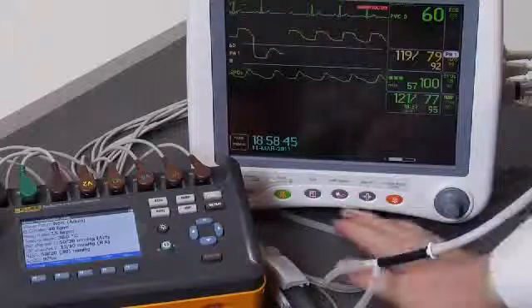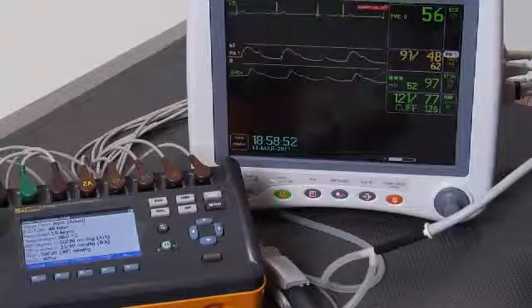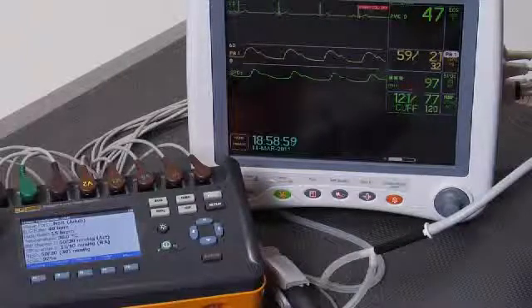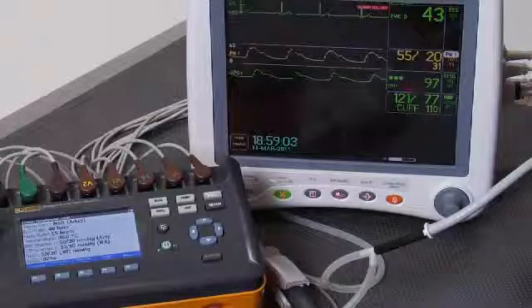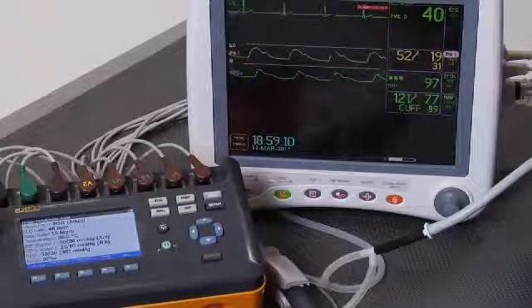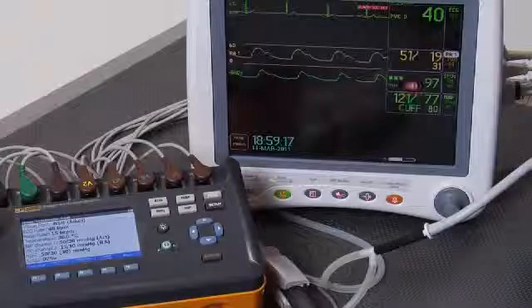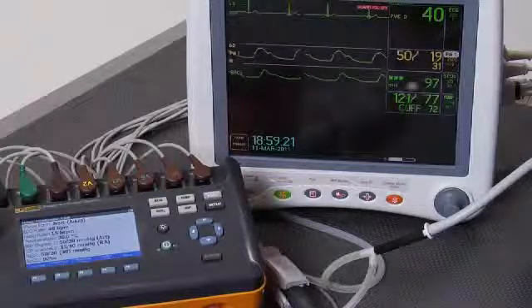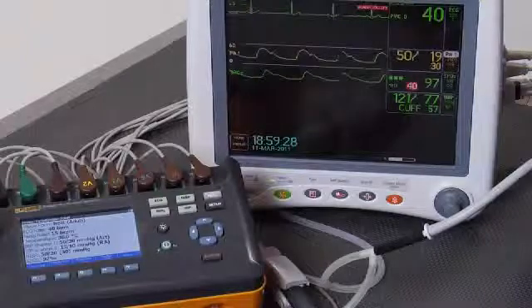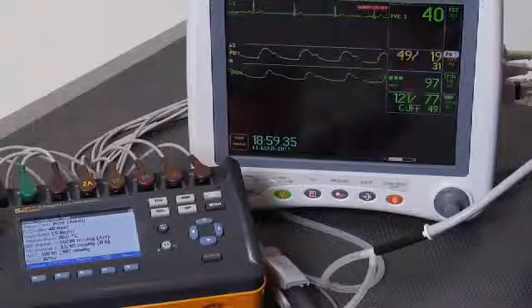We'll go to hypotensive now and start another cuff measurement. We're looking for an ECG rate of 40 beats per minute, respiratory rate of 15 breaths per minute, an invasive blood pressure measurement of 50 over 20, cuff blood pressure of 50 over 20 with a mean of 30, and an O2 sat of 97%. You can see that the ECG rate on the monitor is already 40. Our invasive blood pressure is 50 over 19, very close to 50 over 20. Our cuff is working on getting its measurement, and the O2 sat is 97 — right on with what we're simulating.